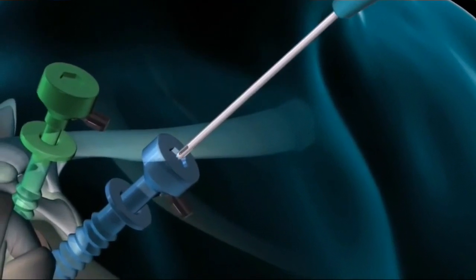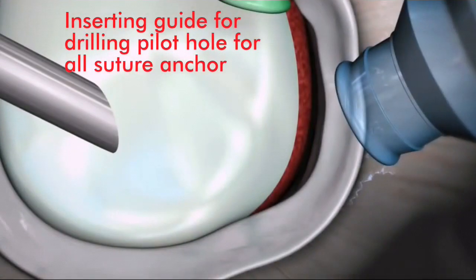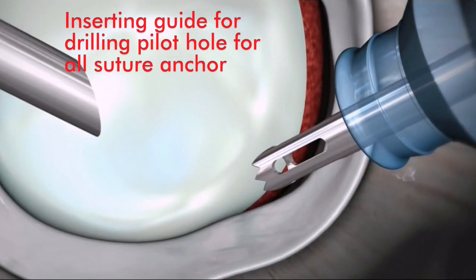Insert the Y-knot drill guide and position it at the desired location on the glenoid. Note that a light tap on the drill guide will help to seat the guide firmly against the glenoid rim.